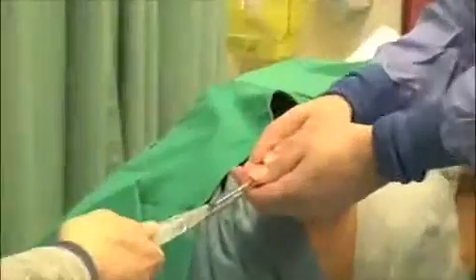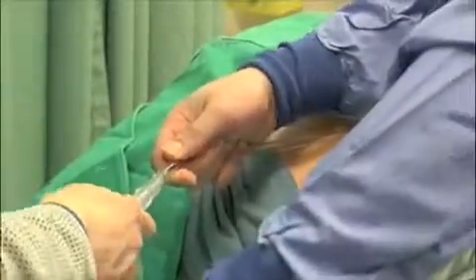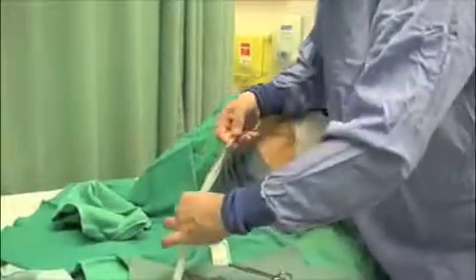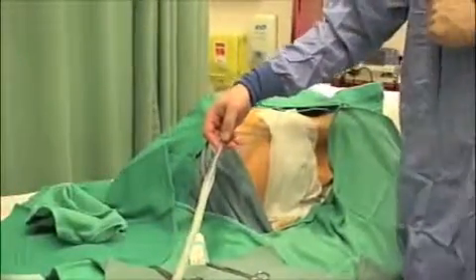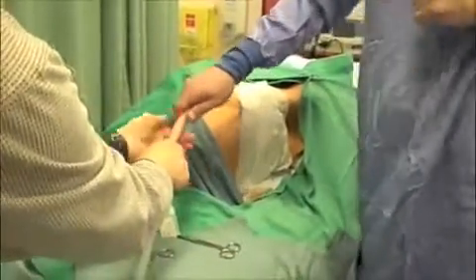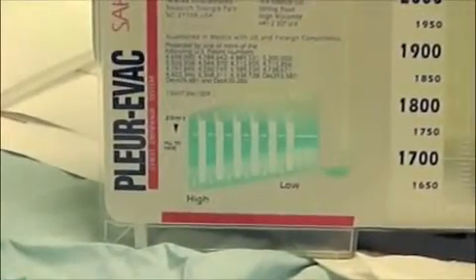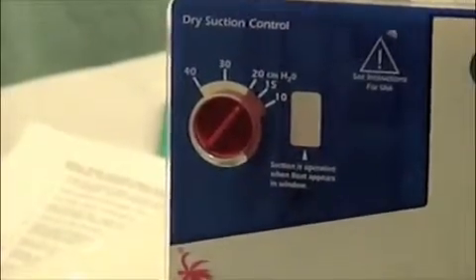Connect the chest tube to an underwater seal apparatus, the Pleurovac. Apply waterproof tape to the connection. Ask the patient to cough and observe for bubbles in the Pleurovac. Set the suction to -20 centimeters of water.